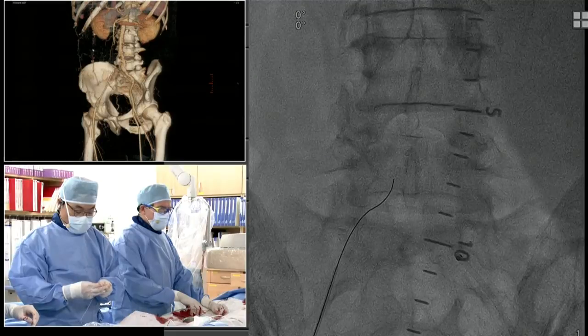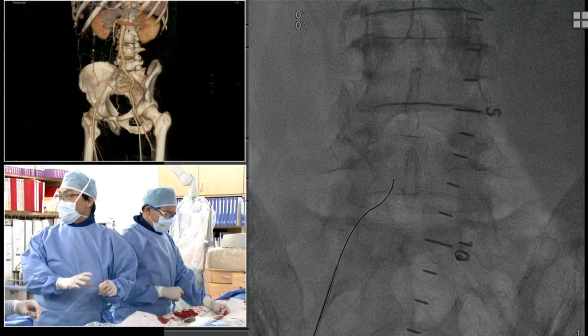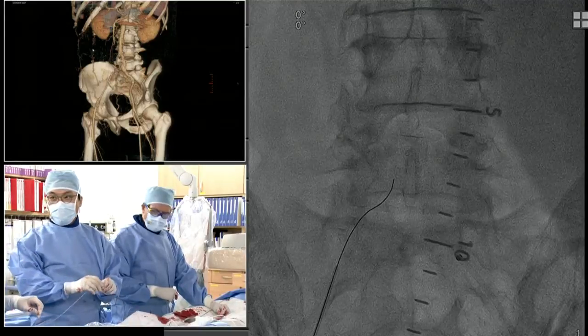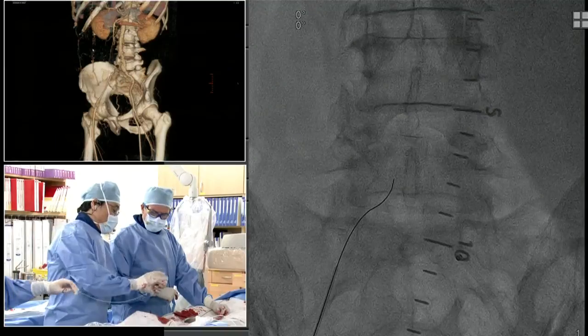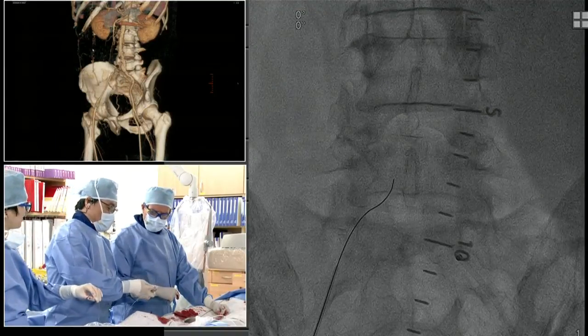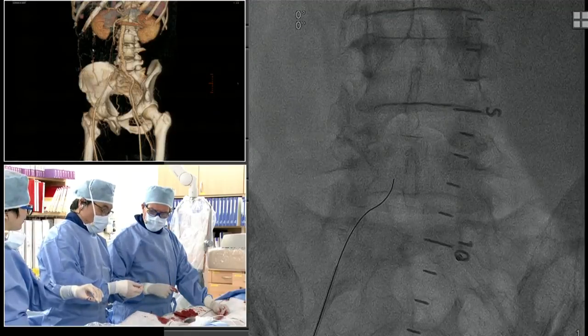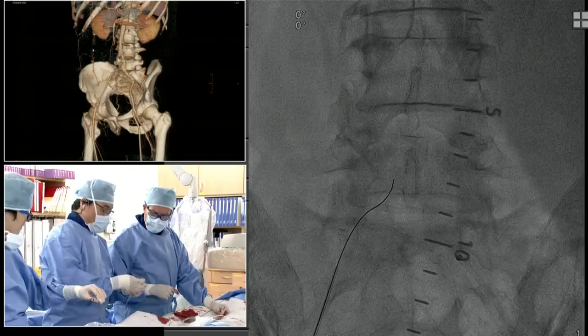Rich, what are you doing now? We're just switching. I screwed up the Omni, so we're going back up with the Omni. We'll go up and over, but the IMA catheter is another option. They say there's no more catheter. No more Omnis? What do you have here? A rim? Use a smaller one. A universal flush catheter. Is this the same one? Yeah, same. Okay, well let's try.